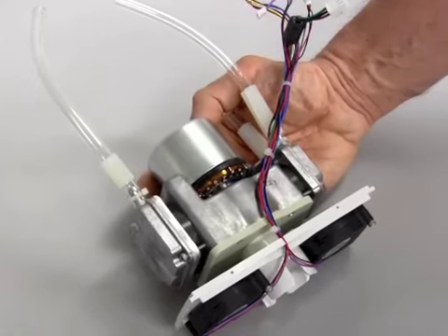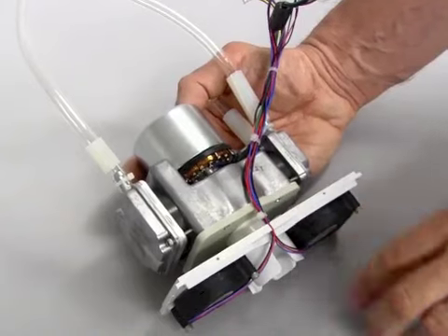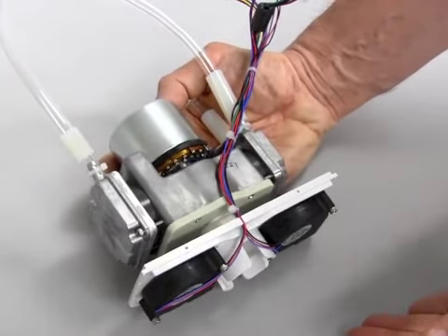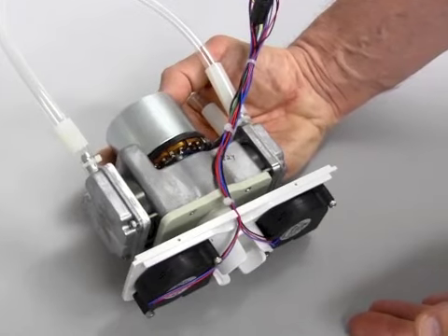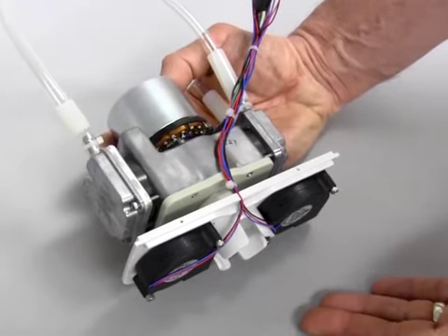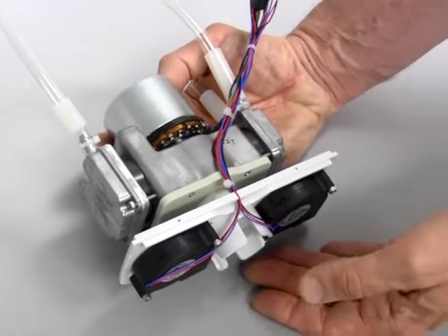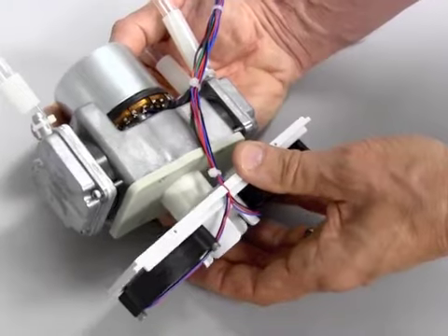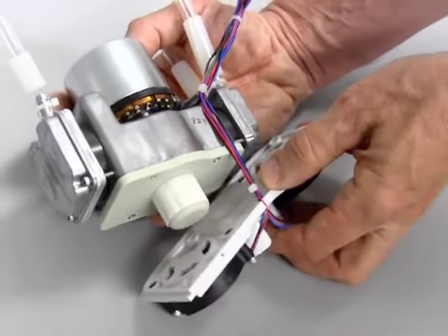Okay, this step shows the compressor and the fan assembly, and this is a good place to show you that if you had to replace the fans on the POC, if you had damaged fans and you had to replace it, this is what you would have to have removed to do this. The fans just pull off the bottom of the compressor, so they're free, right?